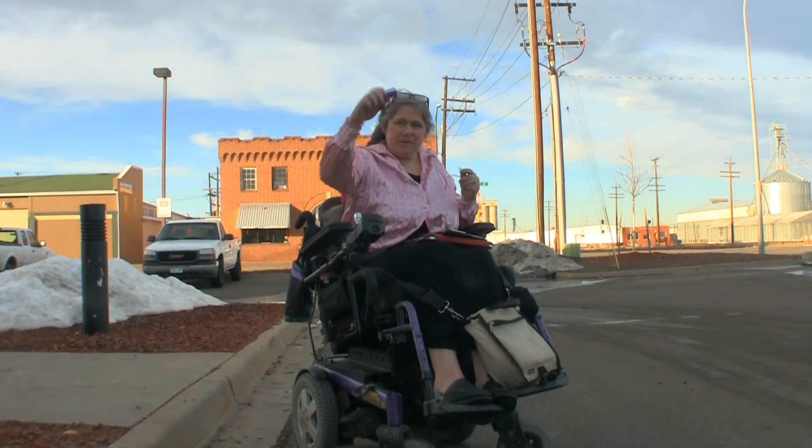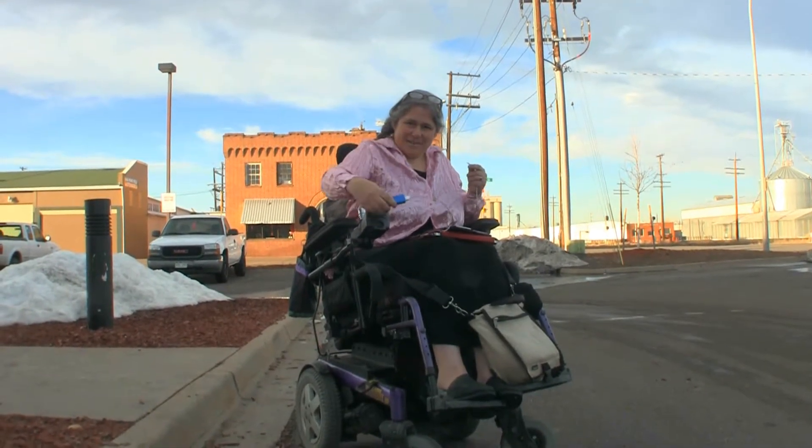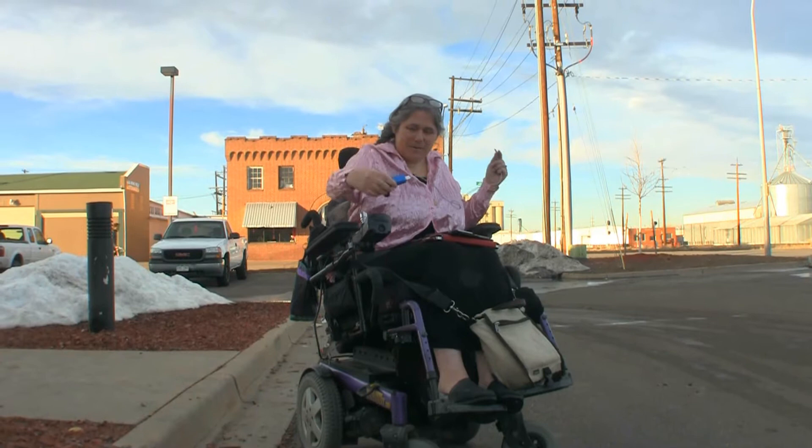I'm demonstrating my new Superman Cripple Charger. Is that what it's called? Cripple Concepts USB Charger. Cripple Concepts USB Charger.